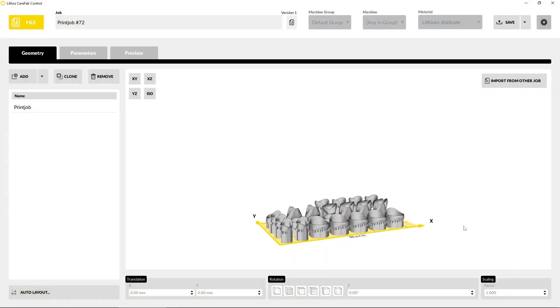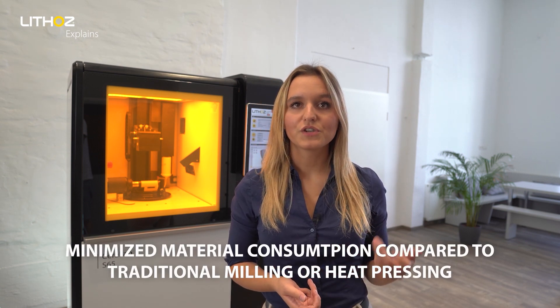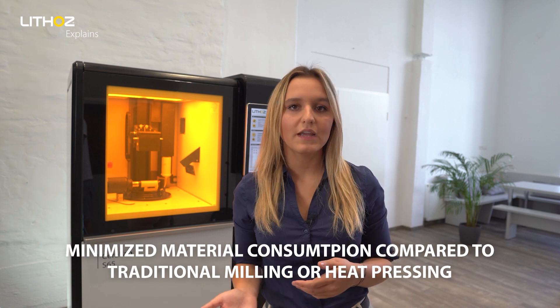Using 3D printing, you can produce cost-effective patient-specific dental restorations as well as thin so-called tabletop veneers. These parts are incredibly complex and accurate, with manufactured fissures shortening the manual process of adapting the veneer to the patient's needs. A digital model is created by scanning the affected tooth, which is then accurately produced using a 3D printer to minimize material consumption when compared to traditional methods of milling or heat pressing.